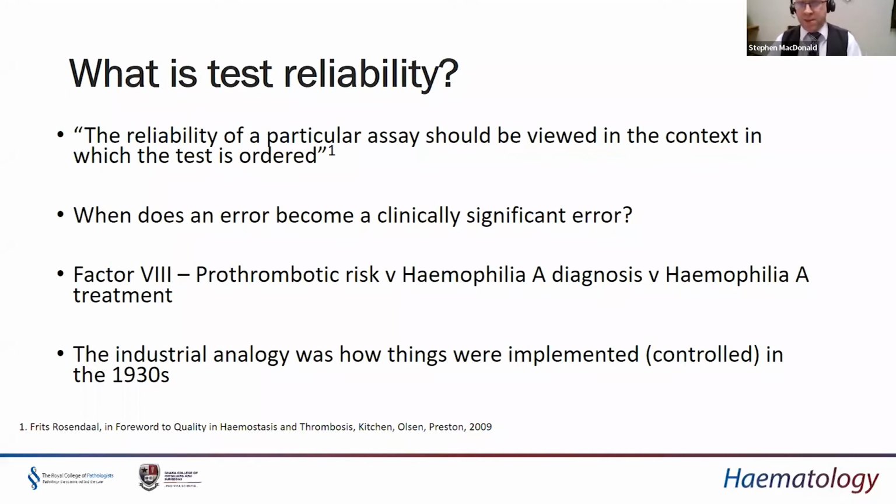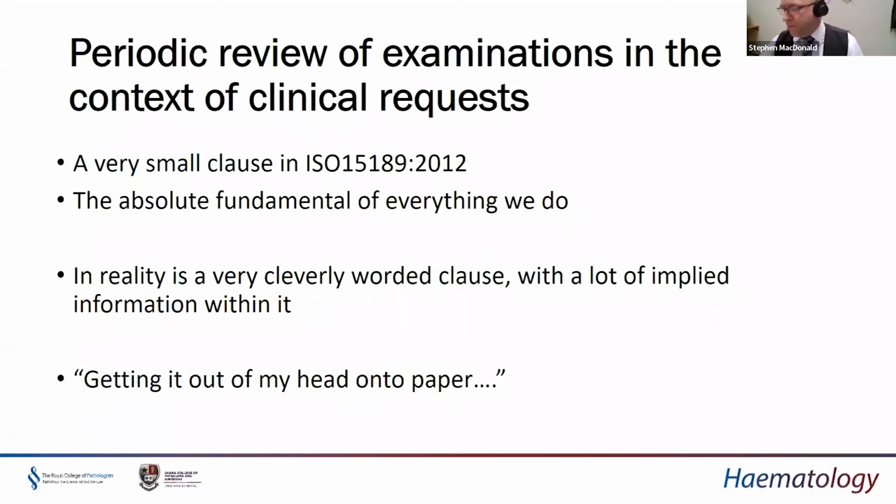So how do we do that? The way that I like to think of this is a way that I've been thinking about it slightly differently recently. And apologies if you're not using 15189 as your main standard. It's what we use in the UK, and it's what I'm most familiar with. There's a very small clause within the 15189 ISO accreditation document for medical laboratories that states that there should always be a periodic review of examinations in the context of clinical requests.